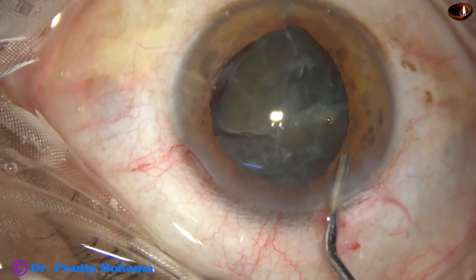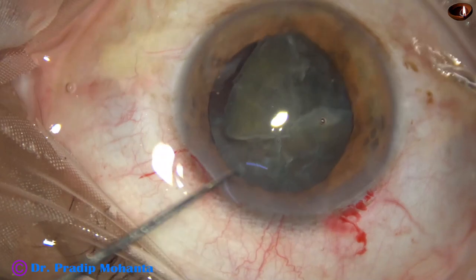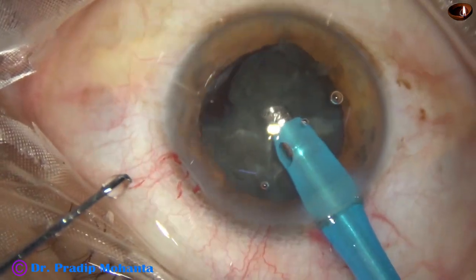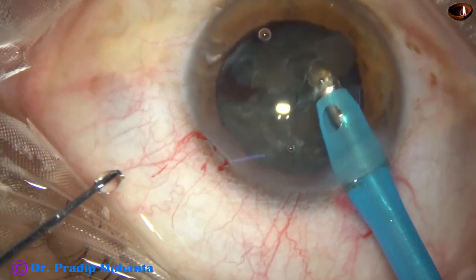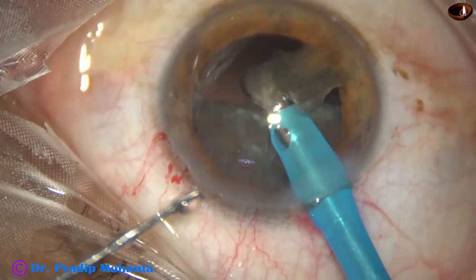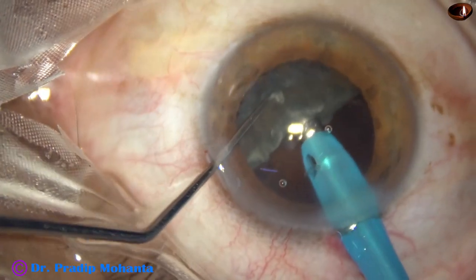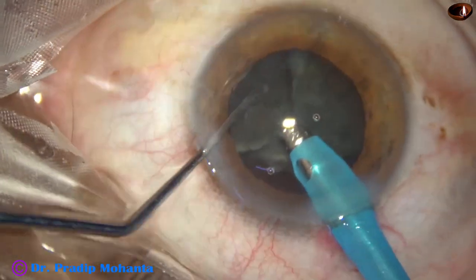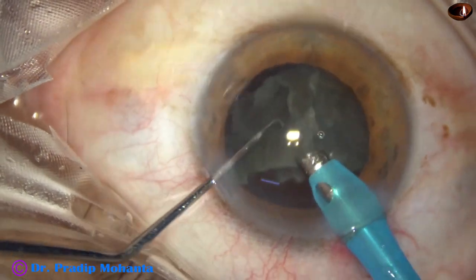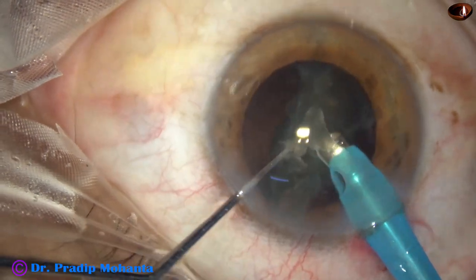I inject some more viscoelastic and go again with the phaco needle. Ultrasonic energy is 60%, flow rate is 45 ml per minute, and vacuum is 450 mmHg. Single-handedly, I could get more followability and emulsify one hemi-nucleus. Now I rotate the second hemi-nucleus, place it in front, but I cannot hold it or divide it completely. So again I go to one end, bring part of the equator out of the capsular bag, then tilt and start emulsifying bit by bit.